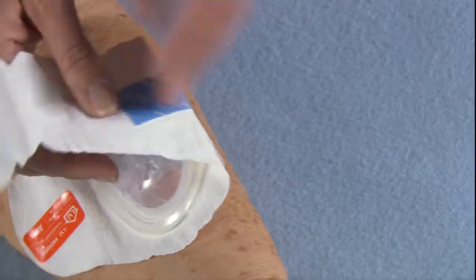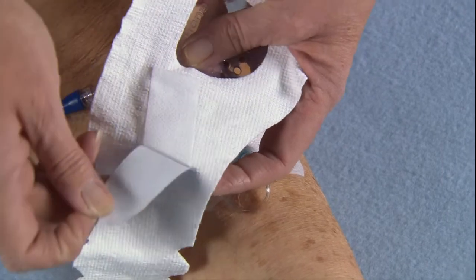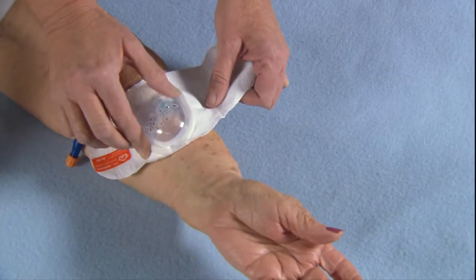Remove the blue release paper to expose a strip of soft surgical tape that keeps the device from sliding. Rewrap fabric, gently pressing the tape into place.